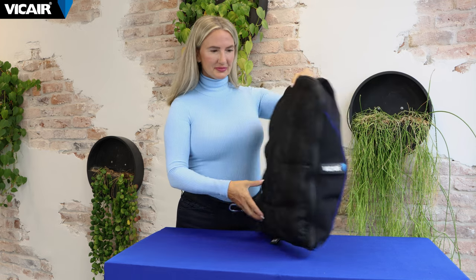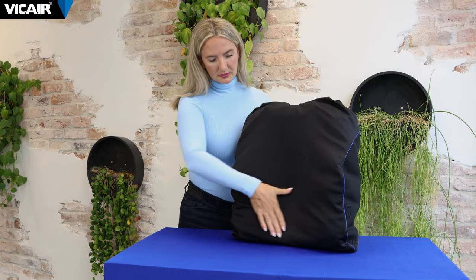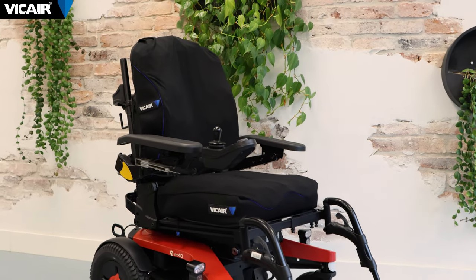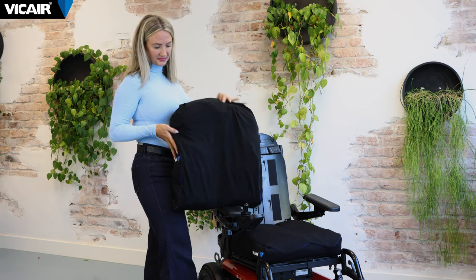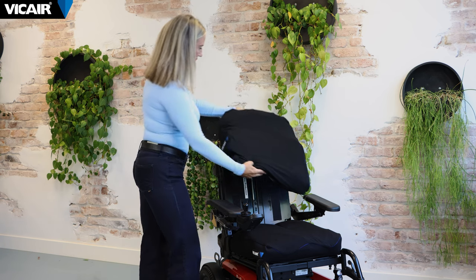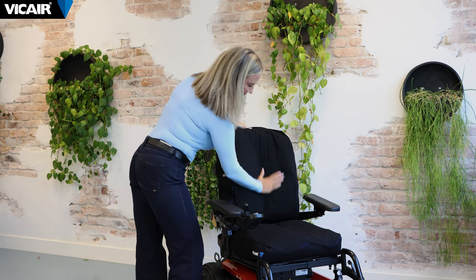It is proficient in accommodating for bony prominences with the spine and scapula. The multifunctional O2 back can be used in several types of back systems and in tilt and space chairs. The cushion is easily fixed onto a solid back support by using hook and loop strips or velcro.